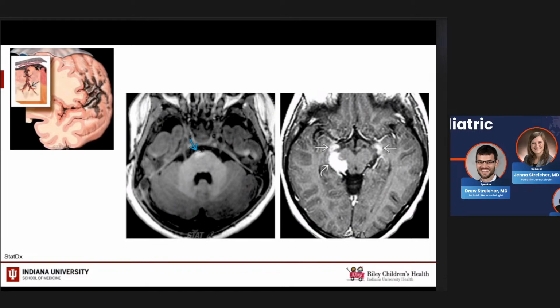It is still T1 bright and a little bit beyond, more intense than that myelinated white matter, but you certainly don't have the conspicuity that you have in areas when the white matter is unmyelinated. So that's kind of a nice example to show that.